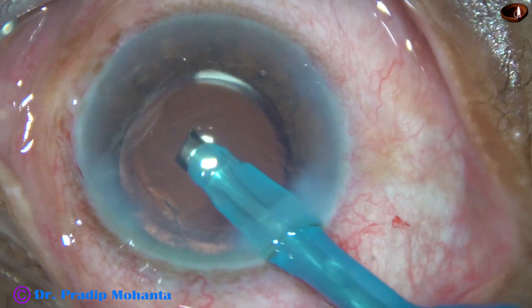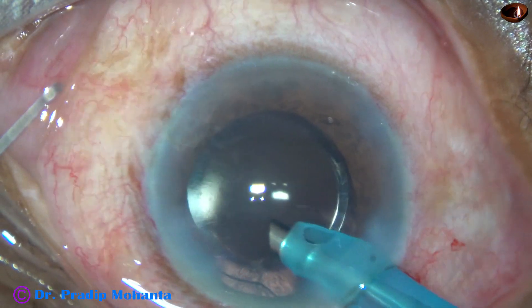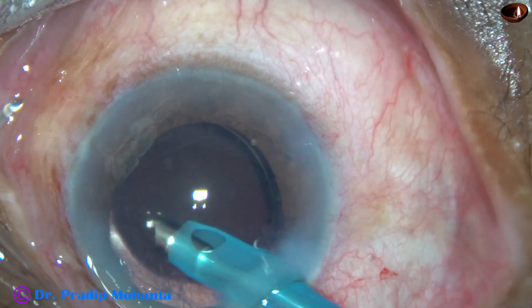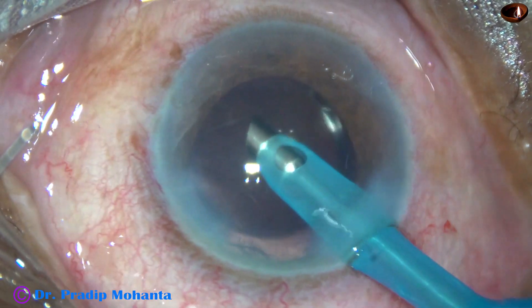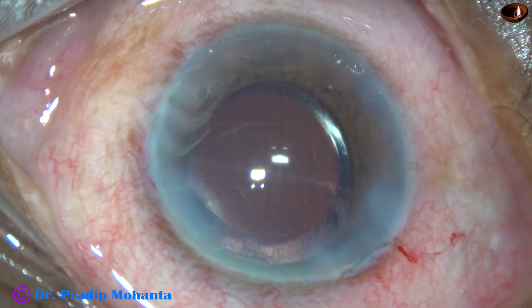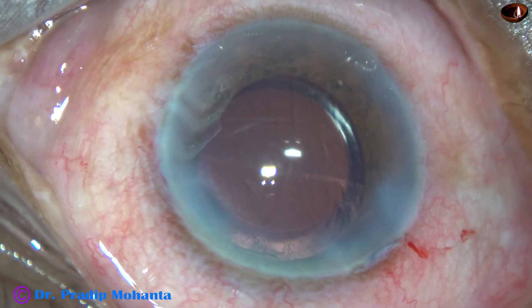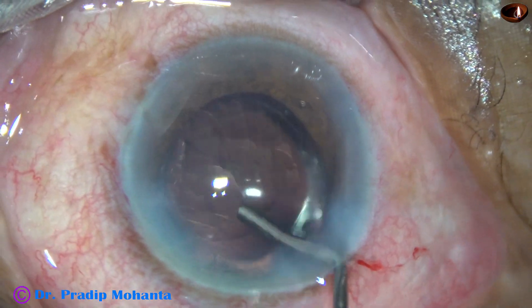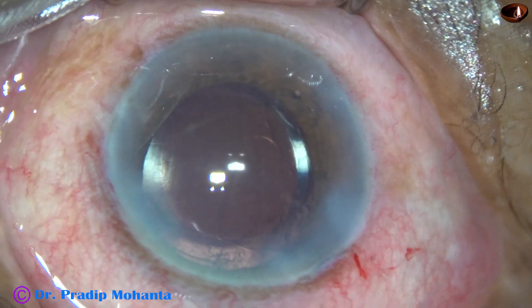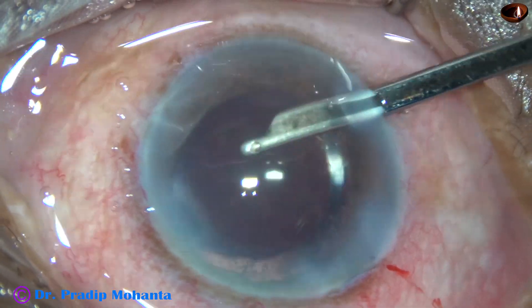Whenever you need to protect the posterior capsule 100% — you want 100% protection — this is the way. Other instruments like posterior capsule protector, an iris spatula, or a long chopper all provide only partial protection. But the IOL scaffold protects the posterior capsule 100%, offers 100% protection.